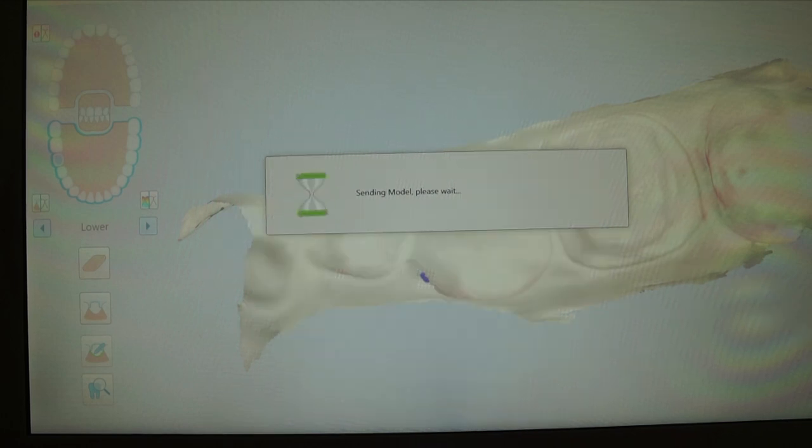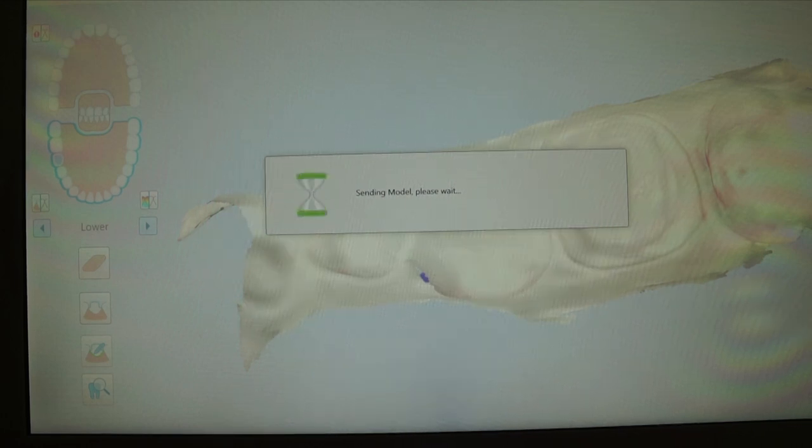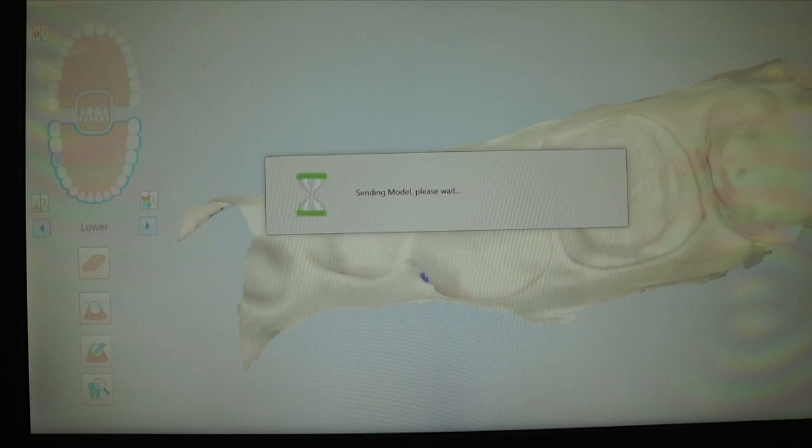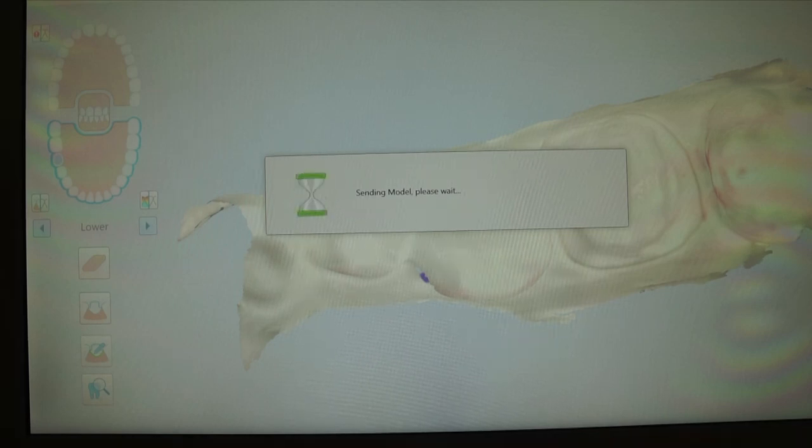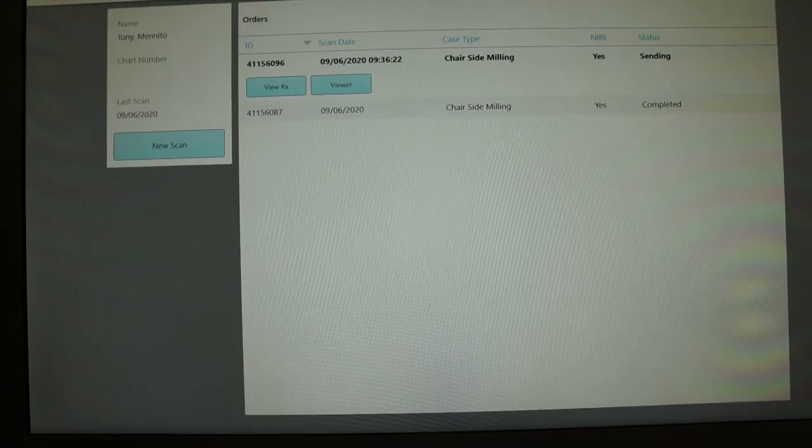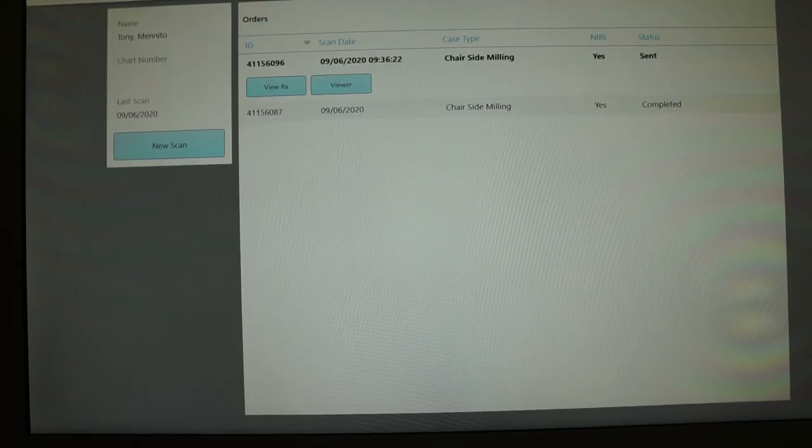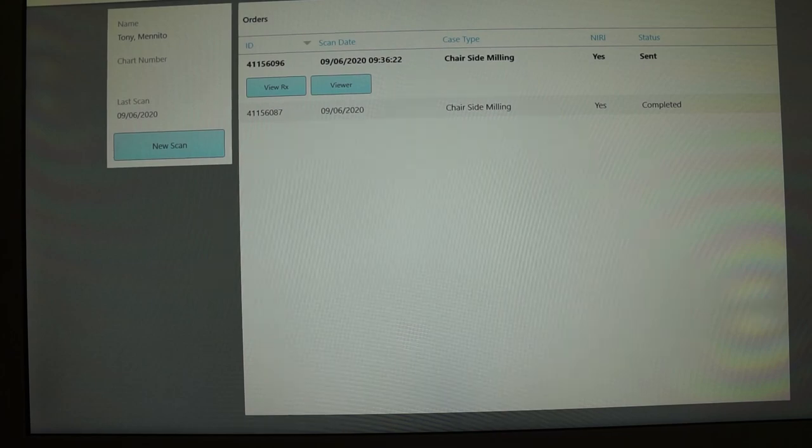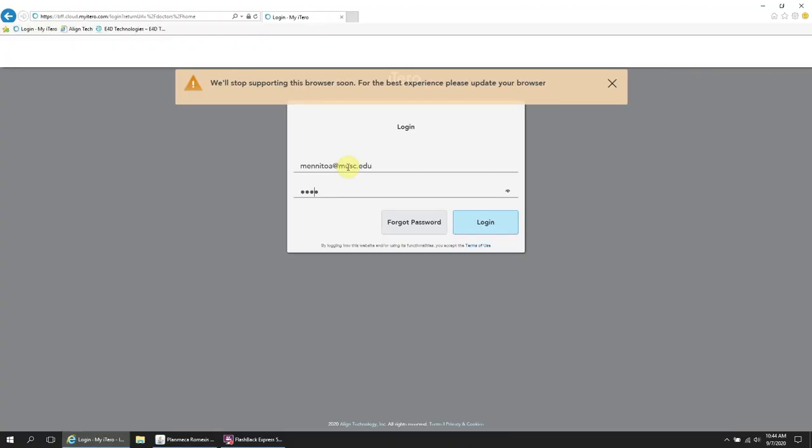Once you're happy with your preparation, you're going to send the file. And at this point, you're going to jump onto the laptop that you have set aside for your design software. That will either be Romexis or Design Center.